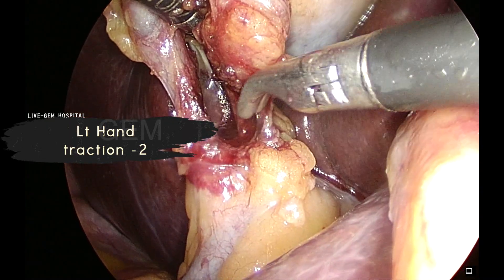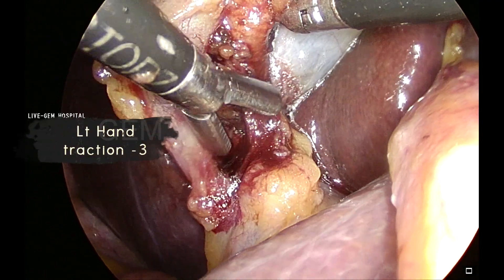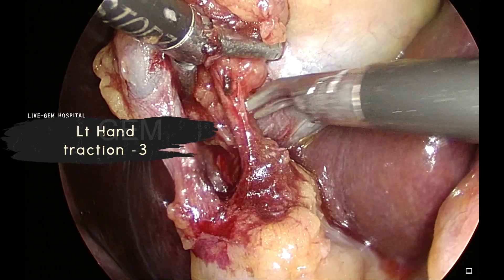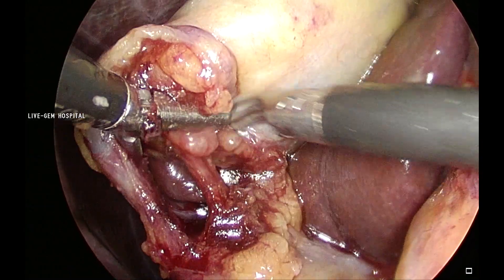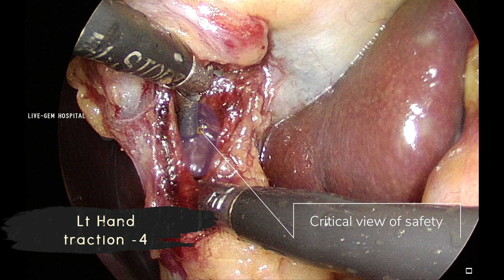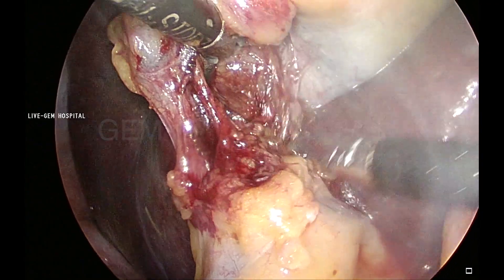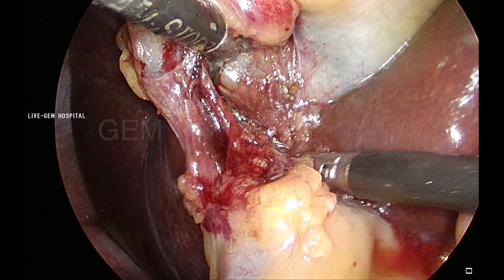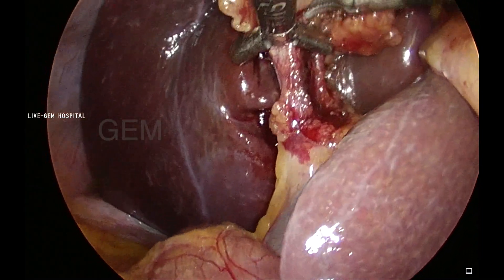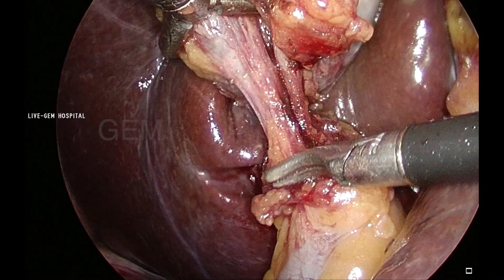Now you can see I am just closing the instrument and pushing the infundibulum — this is another type of traction so that the artery becomes stretched. Now again I want some more exposure. I open and push the artery towards the infundibulum. I am not holding the artery — I just open the instrument and push it. This gives a very good exposure, and now I am going behind the artery, viewing the critical view of safety, which is very important: two tubular structures entering the gallbladder. Seeing the liver through this window, you can confirm that only these two tubular structures go only to the gallbladder — that is the safety view we are achieving now.